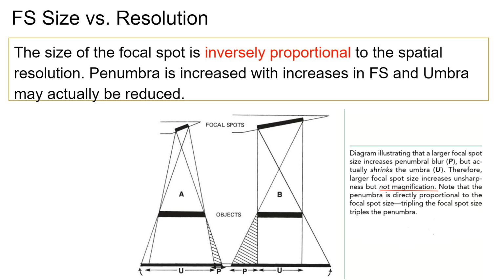So this one has better spatial resolution. But the overall size, from here to here, these two are the same, right? Yeah, this is the same. Those two are the same.